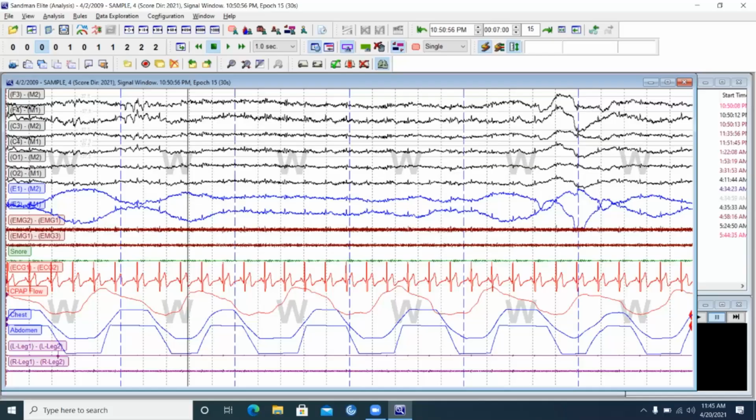So the more you turn up the sensitivity, the shorter the signal is going to be on the screen. Remember that triangle? It relates back to that equation.